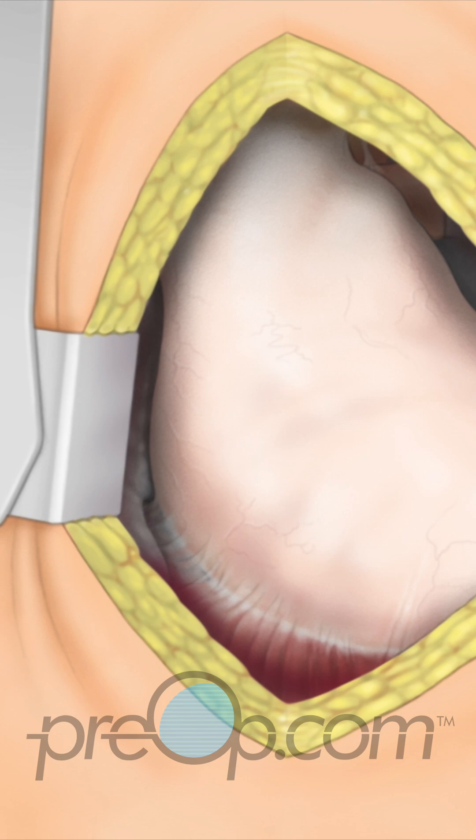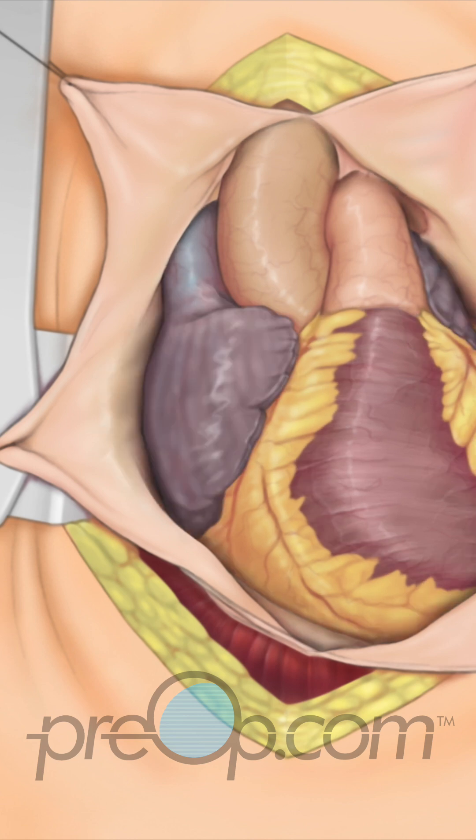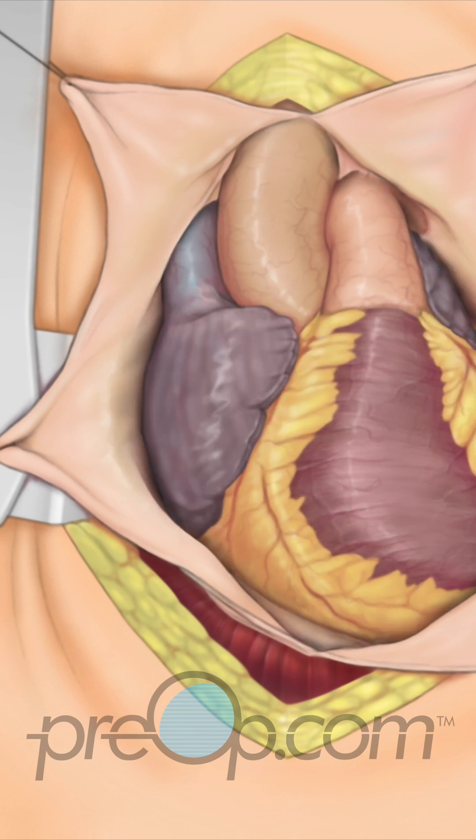The protective sac that surrounds the heart, called the pericardium, is opened. The surgeon inspects the heart and identifies the vessels to be bypassed.